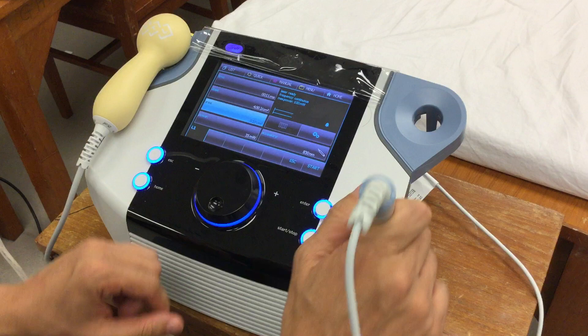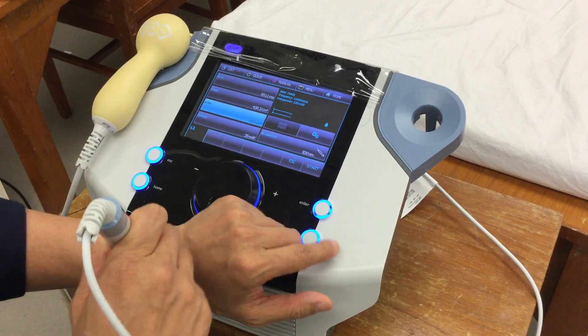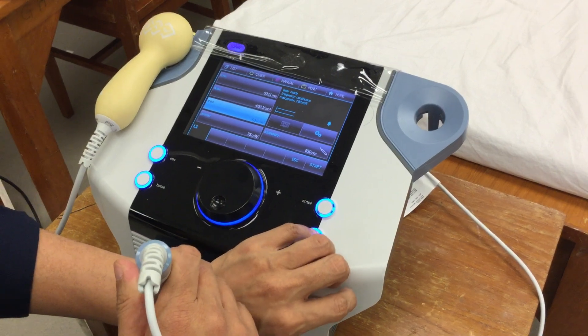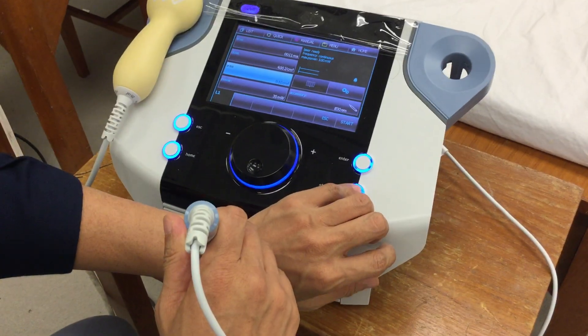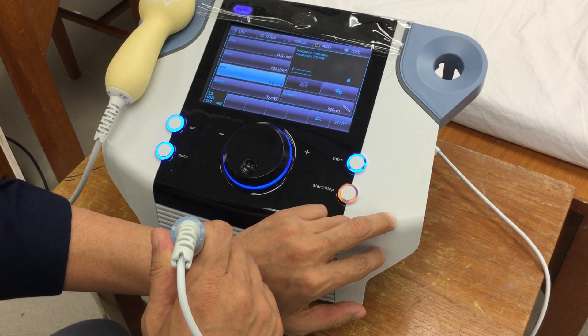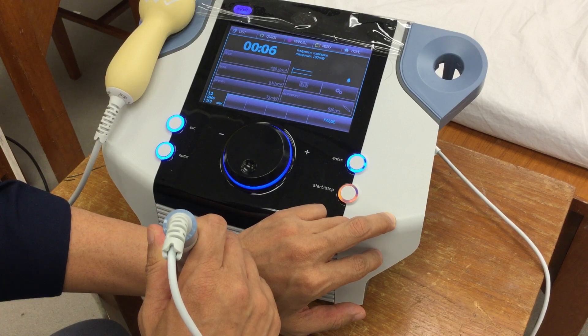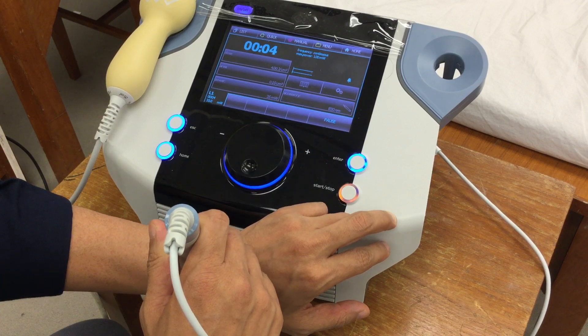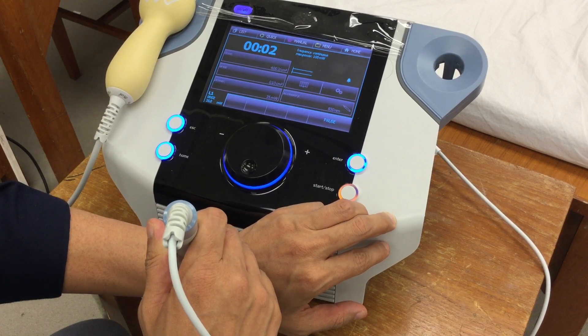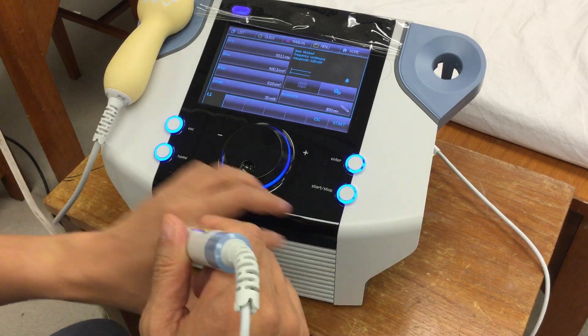Then you simply press the start button. Press the start button here, and it will give you the time automatically. When it's done, it will stop.